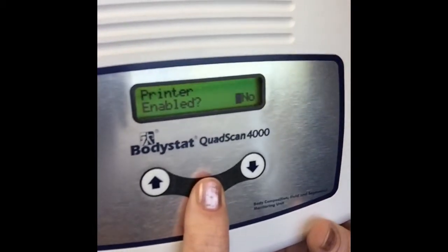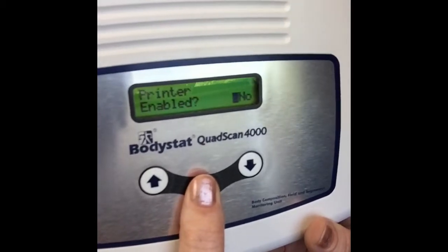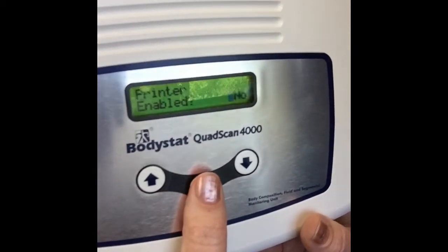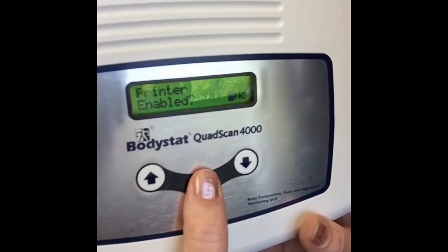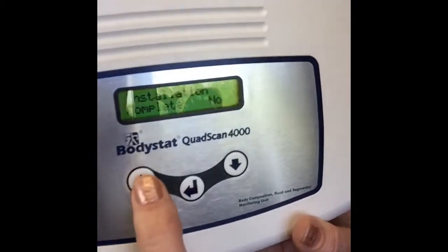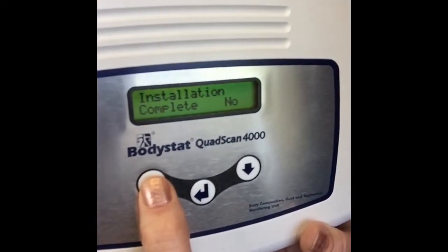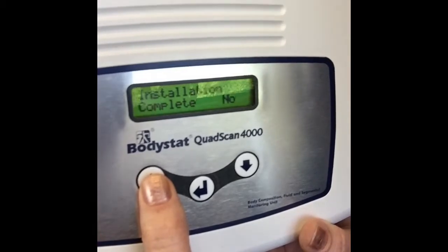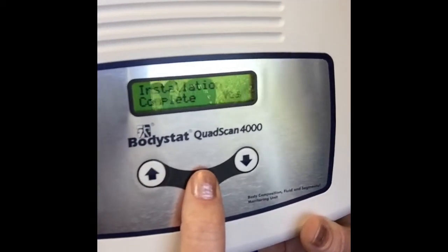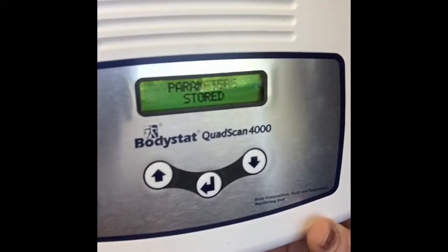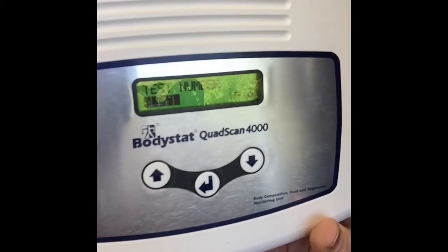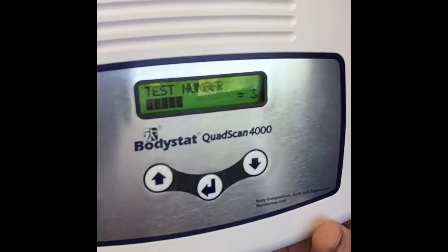At the moment we don't have a printer enabled — I will in another video explain how to pair a printer, but for now we'll select no. It's very important not to pass the next screen, because this screen will save all your parameters. Just click up to say yes and press enter to confirm saved — your parameters have all been stored and it will take you through to the next test, ready to go.